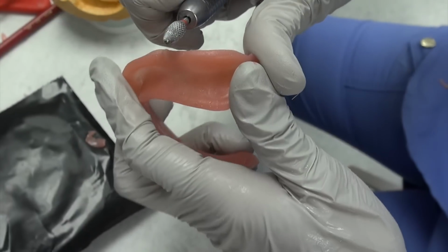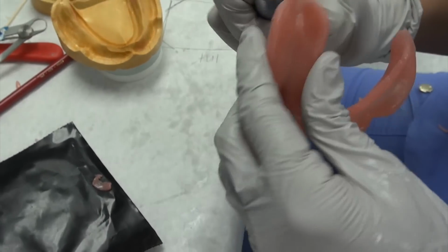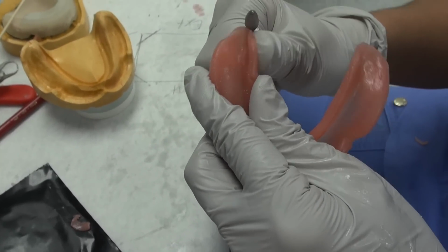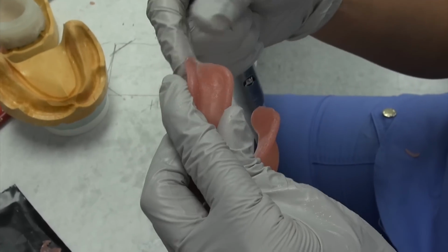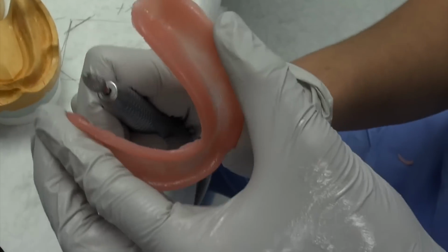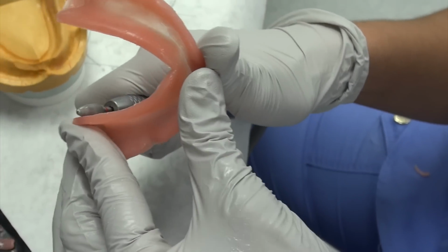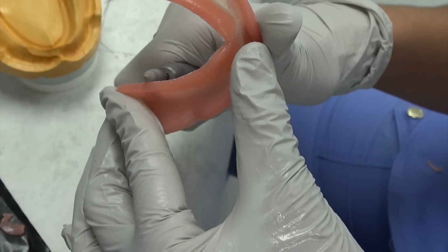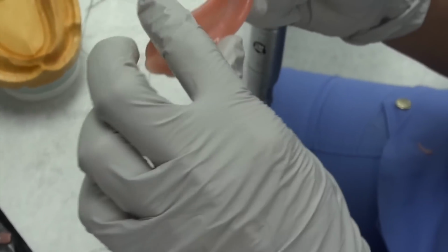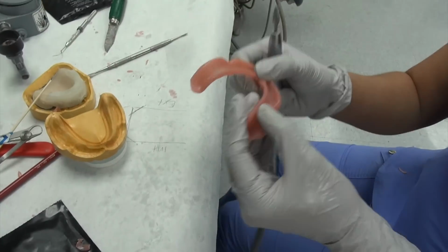So watch out, you don't want to come at too much of an angle because you'll make it short. Okay, so very, very smooth now. Same here. And see, that's why I'm holding it more flat. So anything that's protruding over that border is being captured as opposed to making it short. Okay, so that's all for that area.